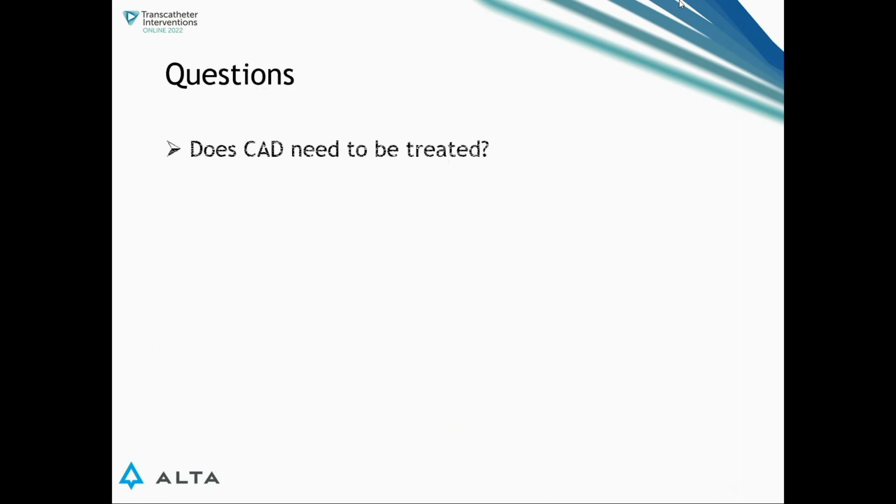Next slide. So based on that evaluation, we thought we'd start the conversation with what to do about the coronary disease, often discovered somewhat incidentally in the evaluation of patients with aortic stenosis. There are three things that we weighed in our considerations. The first is whether the coronary disease is a potential contributor to the patient's symptoms, which may increase our threshold to intervene.